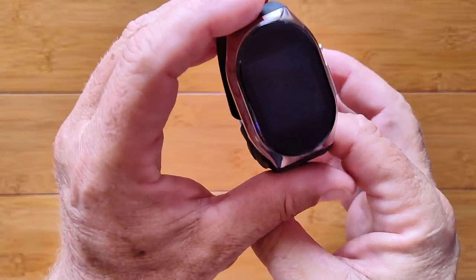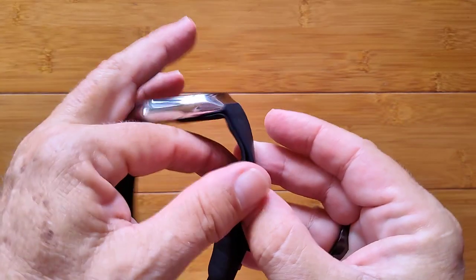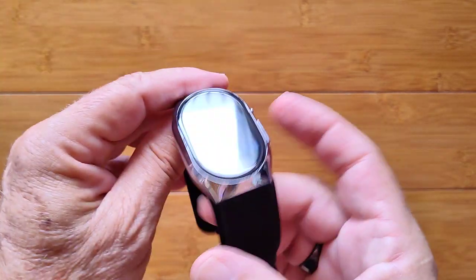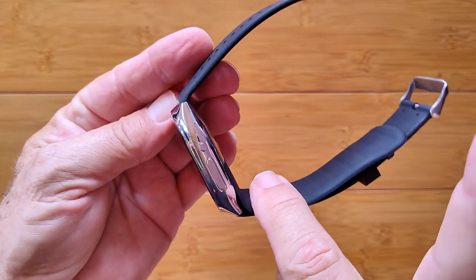This is the BP Doctor Pro. It's a really interesting smartwatch with a bladder that inflates with air from a micro pump inside the watch itself to take a cuff-like blood pressure reading right on your arm.